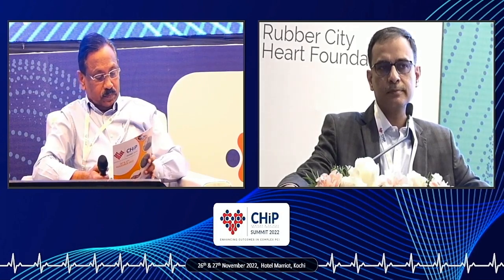Just a point on routine PA pressure monitoring. Do you decide on PA pressure monitoring based on the LV function and hemodynamics, or in any sick patient? How do you exactly decide? For good LV function and a patient who has renal impairment, would you prefer going for a PA catheter, or do you assess the hemodynamics and LV dysfunction, then decide? Second point is regarding the PA catheter. How do you put it in? Do you place the PA catheter inside the cath lab, or do you have pressure monitoring in the ICU, shift the patient to the ICU, have the catheter put in, then shift the patient to the cath lab? What is the dynamics like?